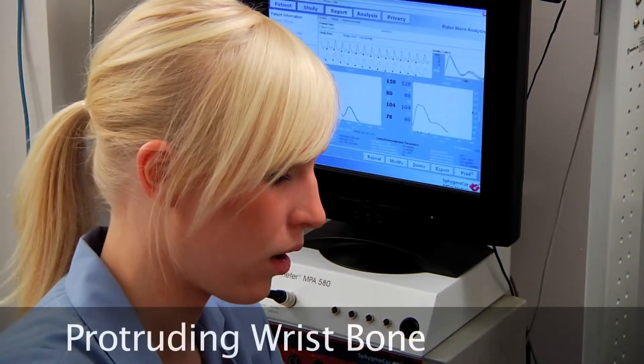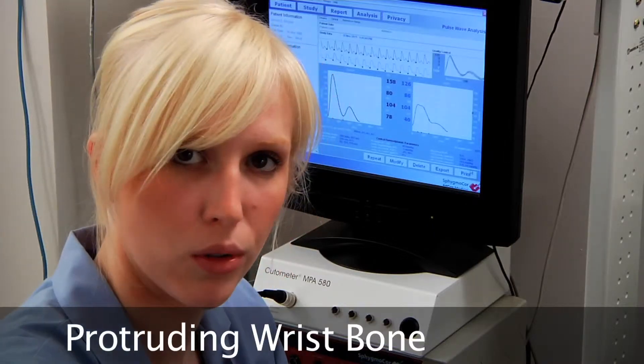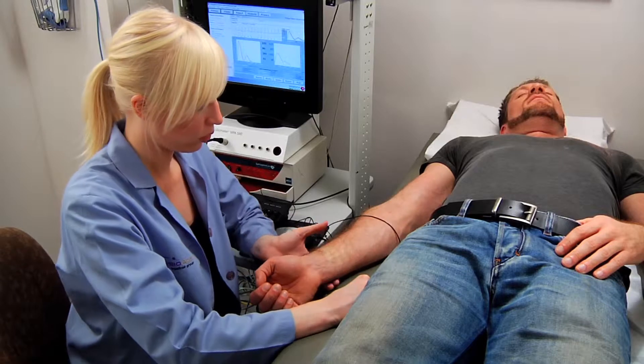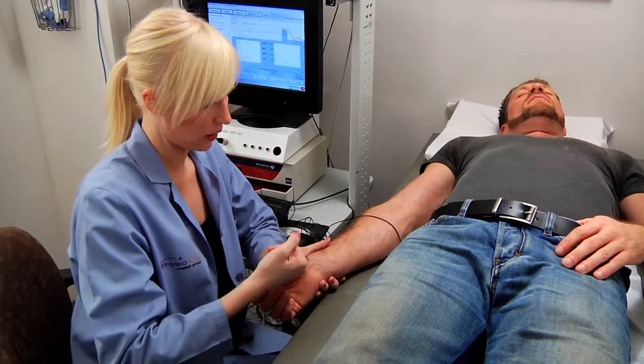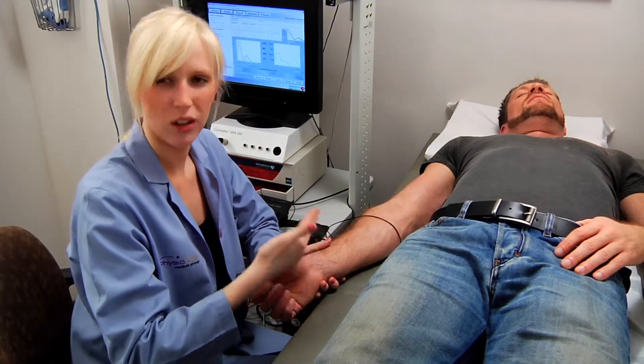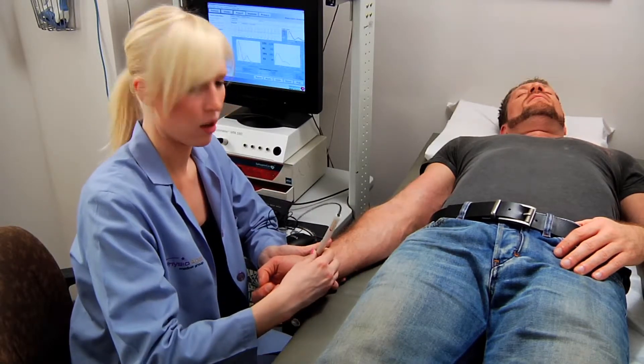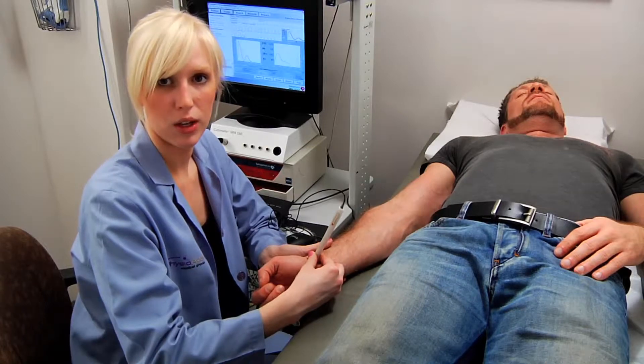It's mostly women who have a very protruding wrist bone. If you really can't get the measurement, just gently turn the wrist in a little bit and hold the wrist. What that does is let the artery fall just a little bit — just enough away from that wrist bone — and now you'll be able to place the probe on the wrist and get a measurement.